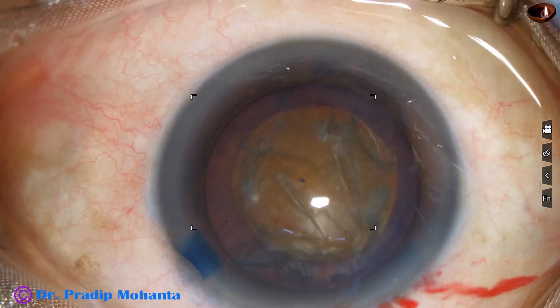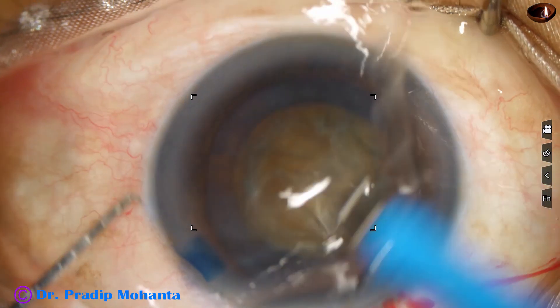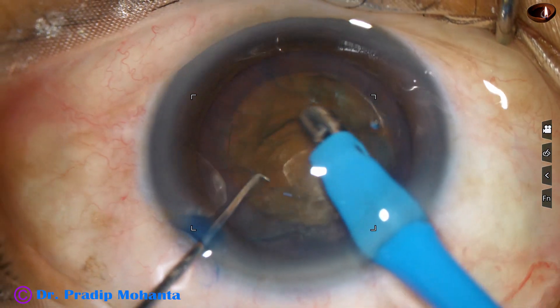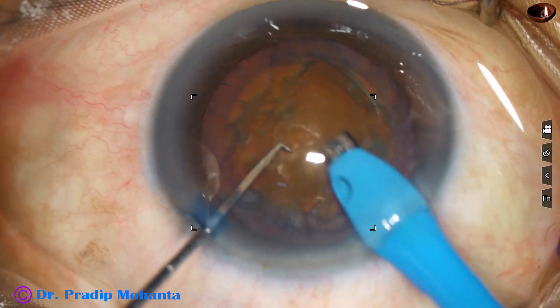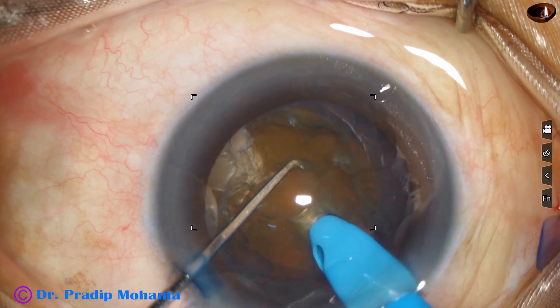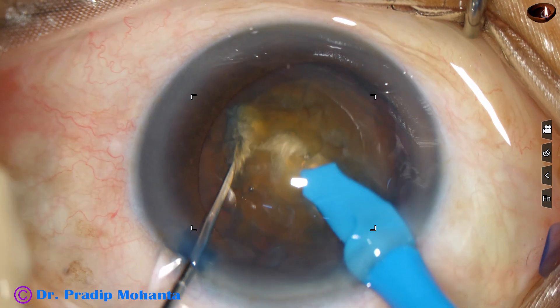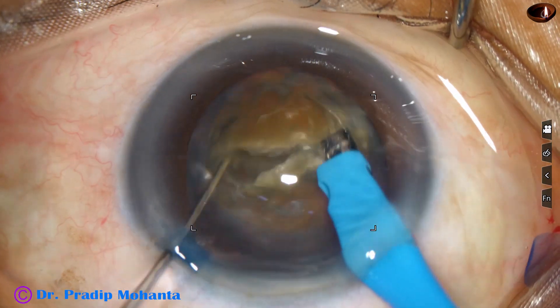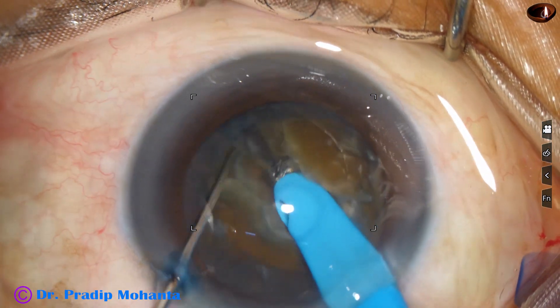And now the anterior chamber has been filled up with 2% HPMC. The phaco needle goes in with its bevel down. Some superficial cortical lens matter is removed. And now watch my technique — Mahanta's submarine jaw. Push the nucleus a little down, go into the substance of the nucleus, travel through the nucleus towards the opposite equator. You have reached almost 75% depth, and the nucleus gets cracked. You can easily divide the nucleus into 2 hemi-nuclei.